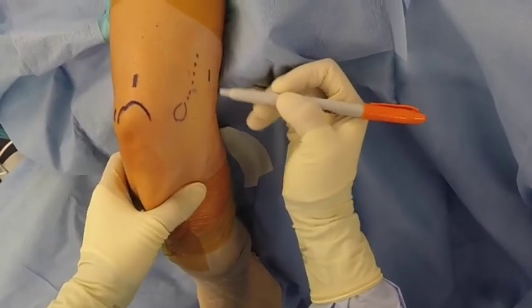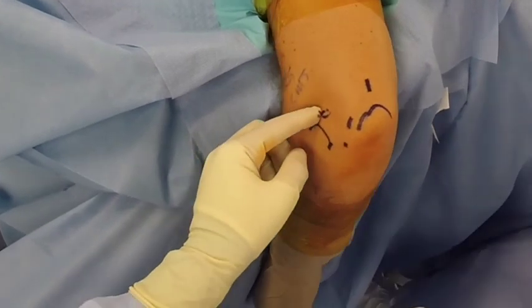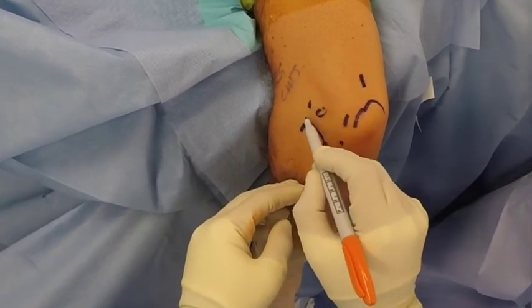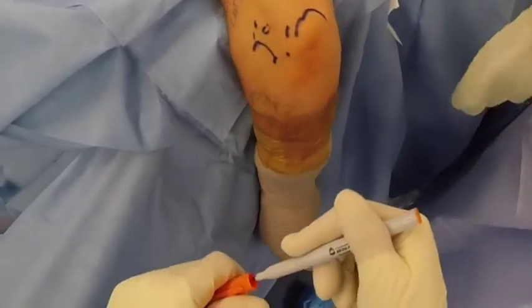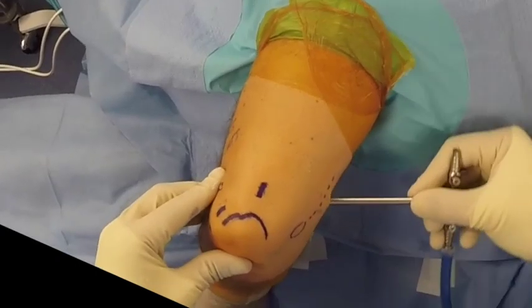The patient was taken to the OR and placed in the lateral decubitus position with the elbow over an arm holder. After marking relevant surface anatomy and raising the tourniquet, the joint was insufflated and the proximal anteromedial portal established.